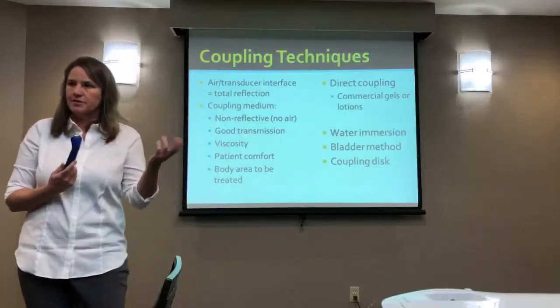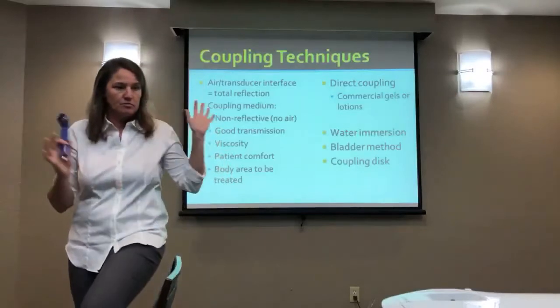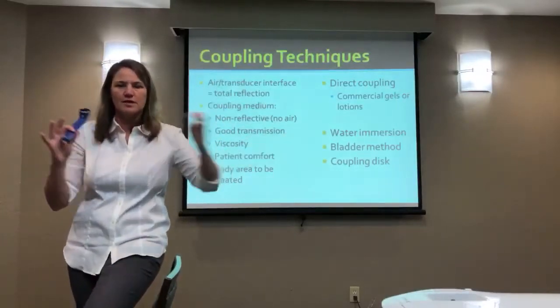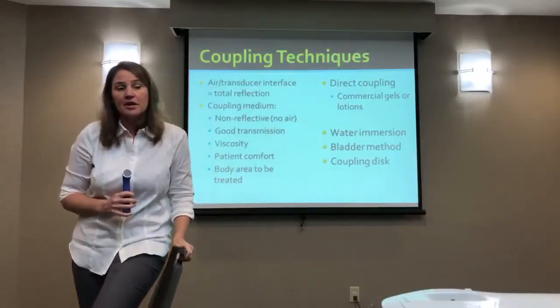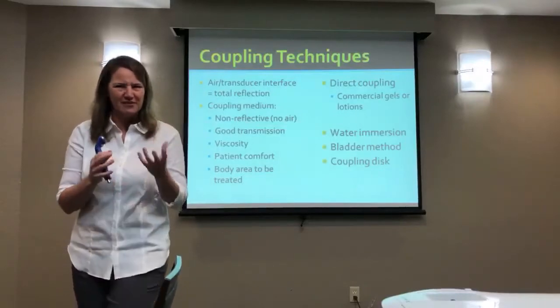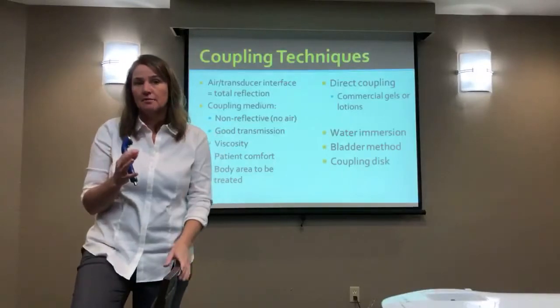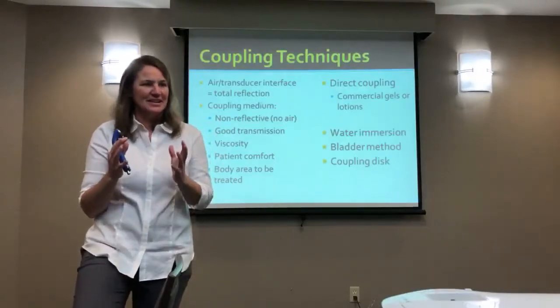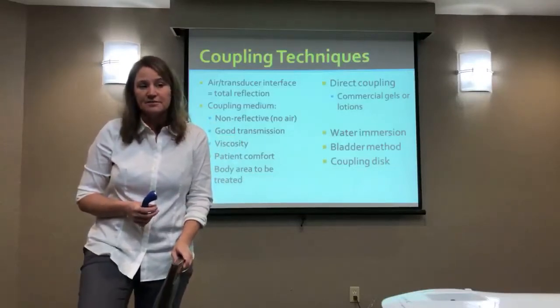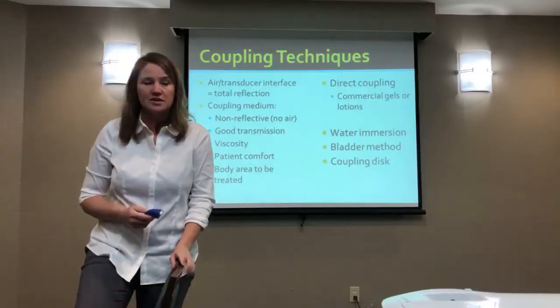So, don't squirt it right on the patient is my recommendation. And think about your hands. The most likely place you're transmitting things is from your hands, from one place to another. Think about the area of the body to be treated. If it's, again, like a hand or a foot, and it's a difficult-to-couple area, it's going to be more challenging. Bucket of water, lots of gel is going to be needed to create a layer that's not going to let air in, versus a larger area where it's not reasonable for you to treat it in one session.